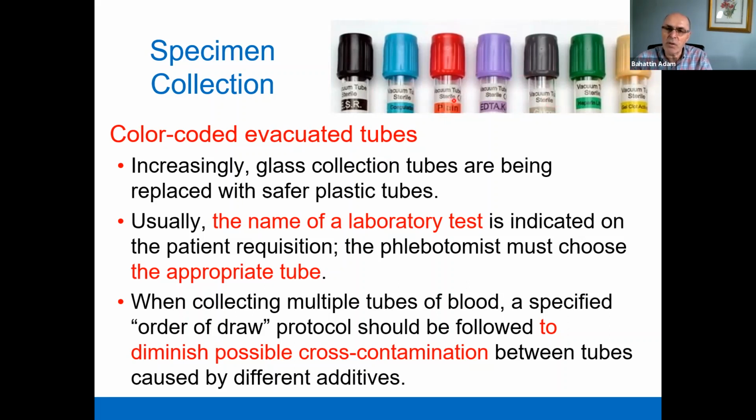You may follow an order of draw, which is provided by each lab. You will be told before you withdraw the blood.